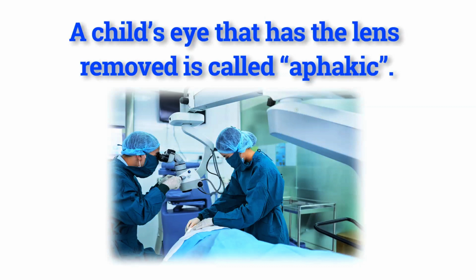Your child's eye doctor will recommend a surgery to remove the cataract. When a child is missing the normal lens of the eye, they are considered aphakic. In order to visually rehabilitate the eye, aphakia is usually treated using glasses or a contact lens, which focuses light on the back of the eye and promotes visual development.